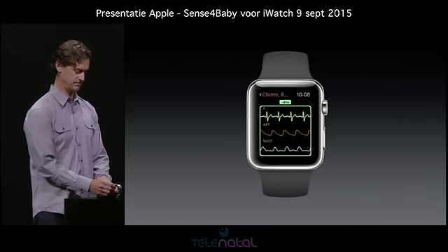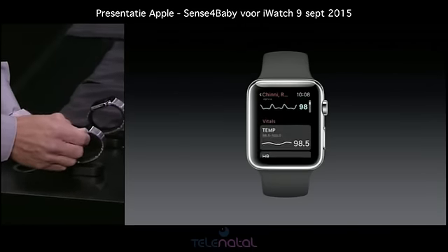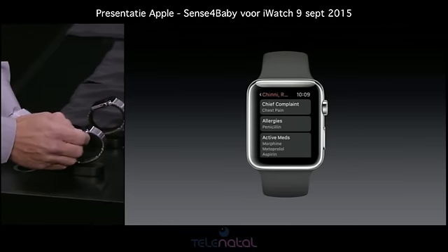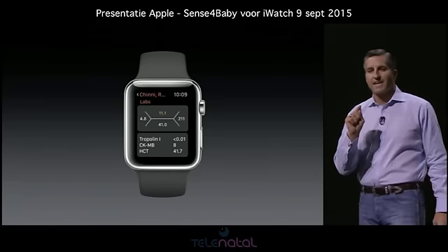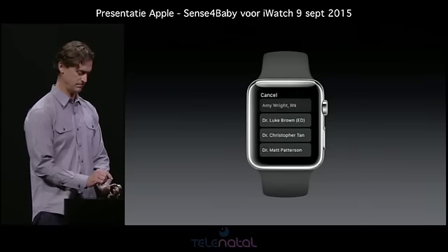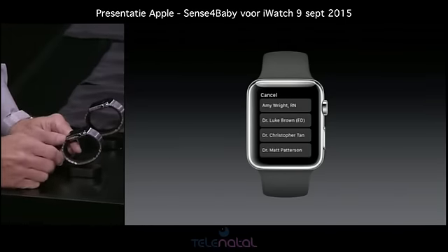Now, as you can see, Airstrip magically pulls all this data together into a single view through our Airstrip One platform. And we make it available to Apple Watch for display. But what is so great is I can take action on what I see. Here, I can send a HIPAA-compliant, secure message to a member of the patient's care team. In this instance, I'm going to order a repeat ECG.